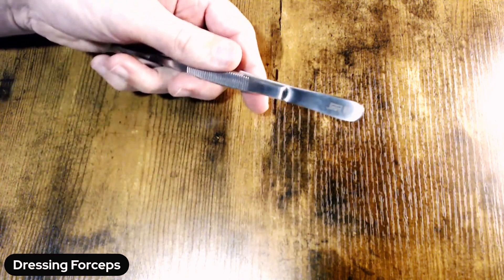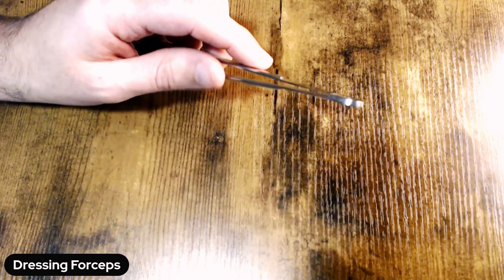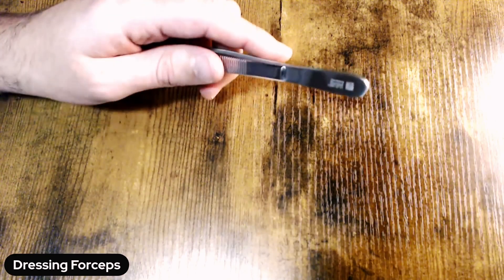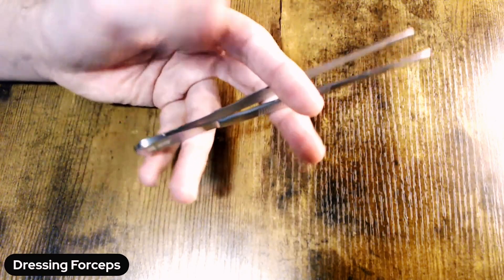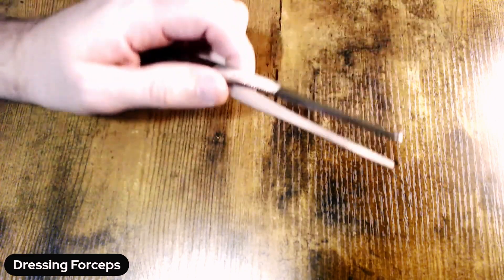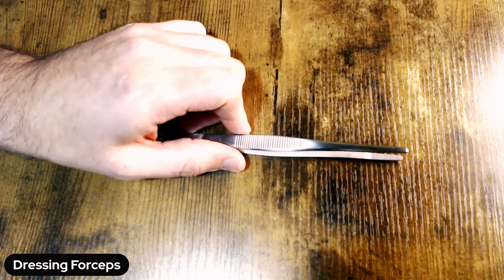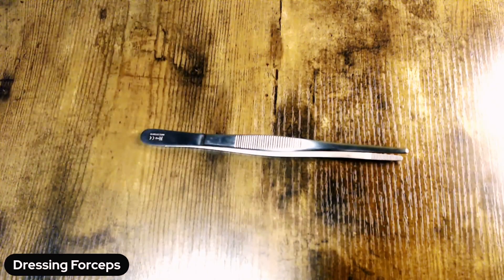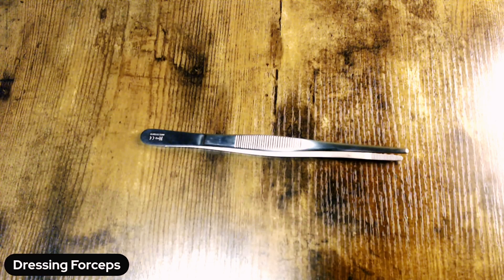And then on the back end of our forceps, you're going to want to look for any cracks in the handle to make sure that this device is not compromised in any way. And sometimes those cracks can be fairly small. So as with all of our devices, it's a great idea to have a lighted magnification tool at your assembly area when inspecting and identifying these devices.